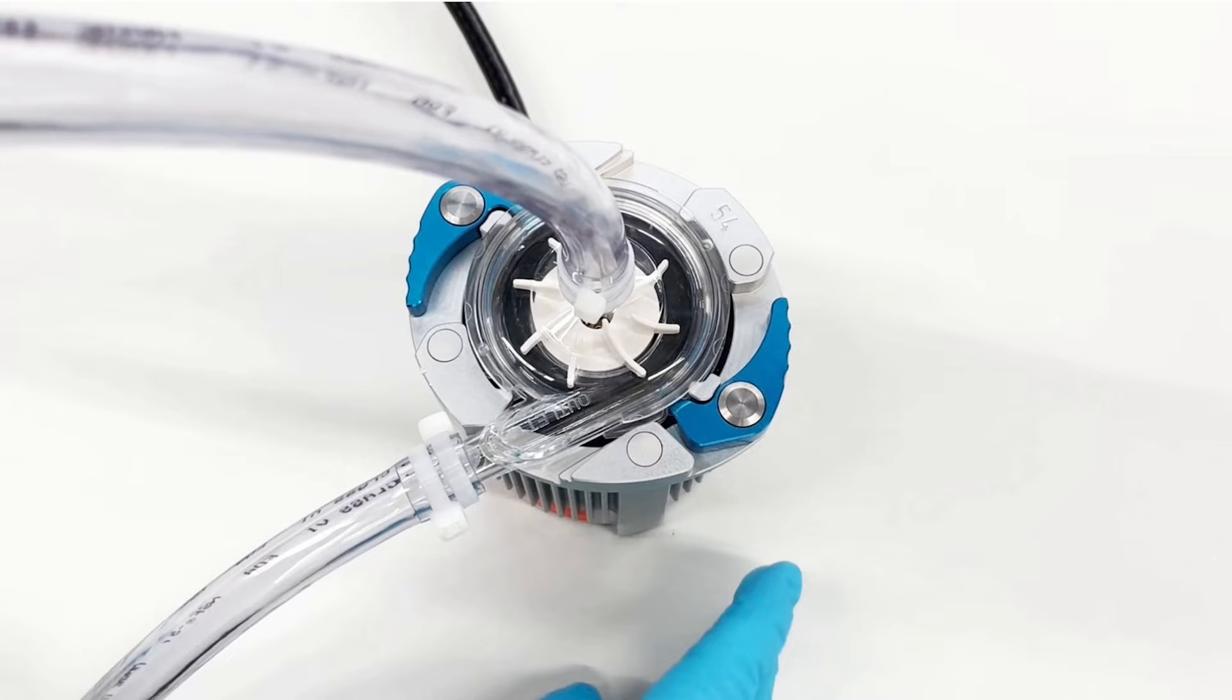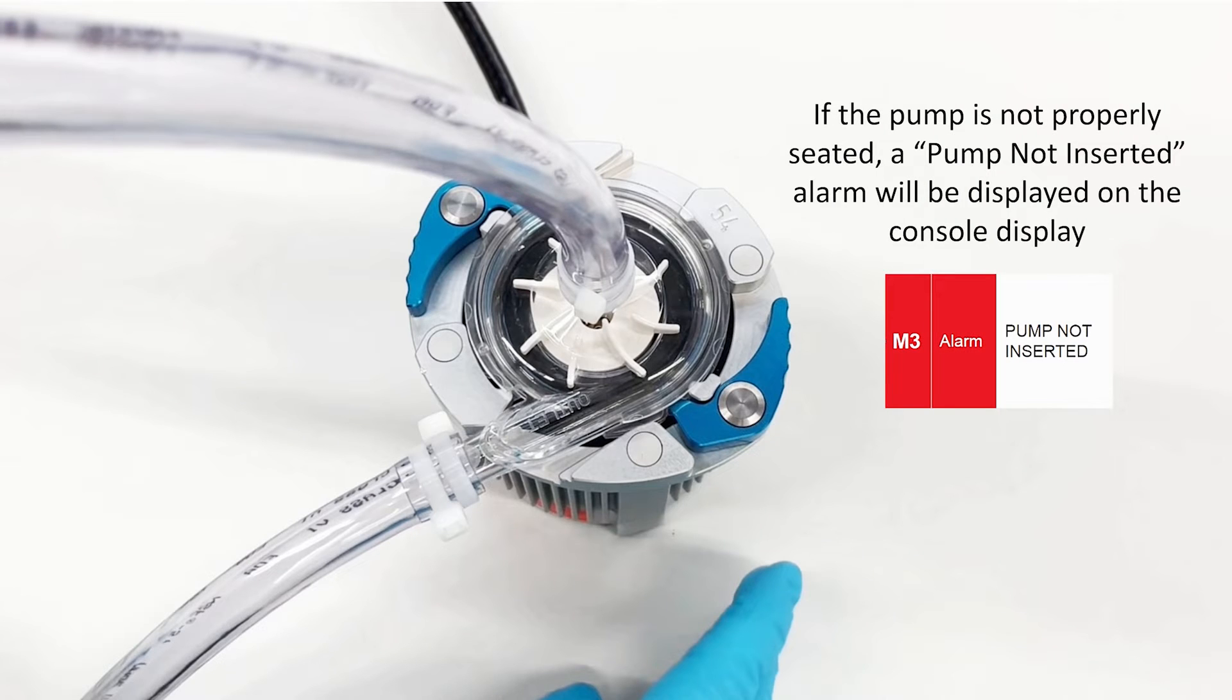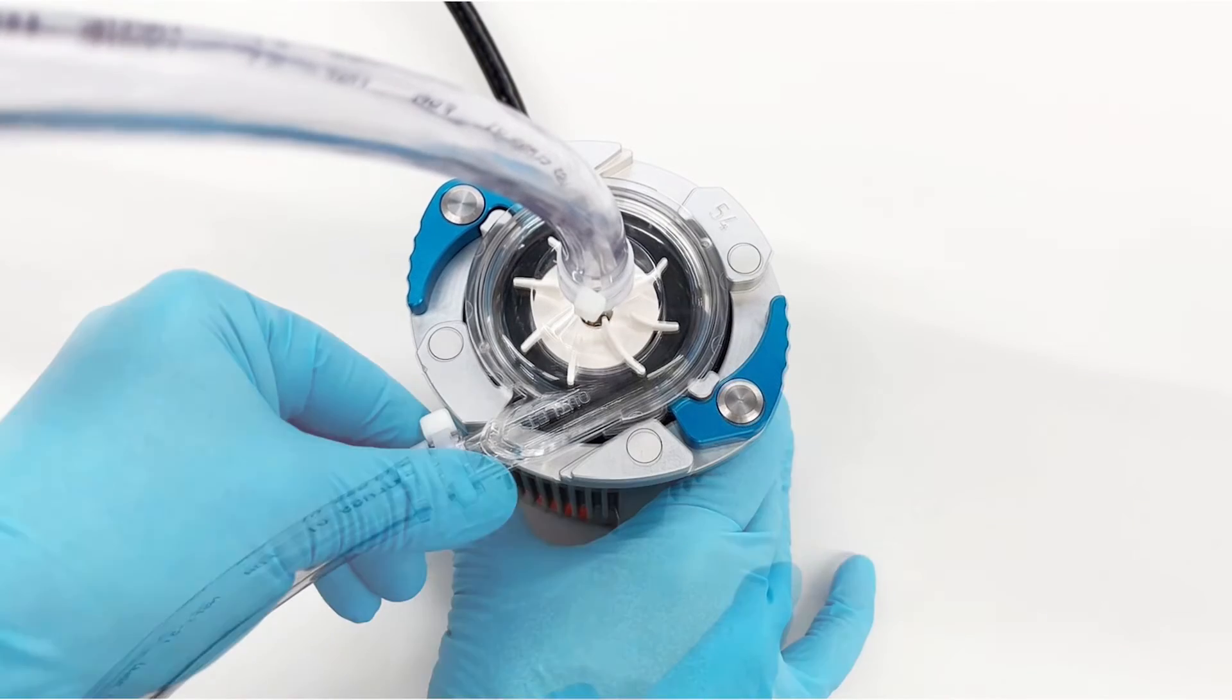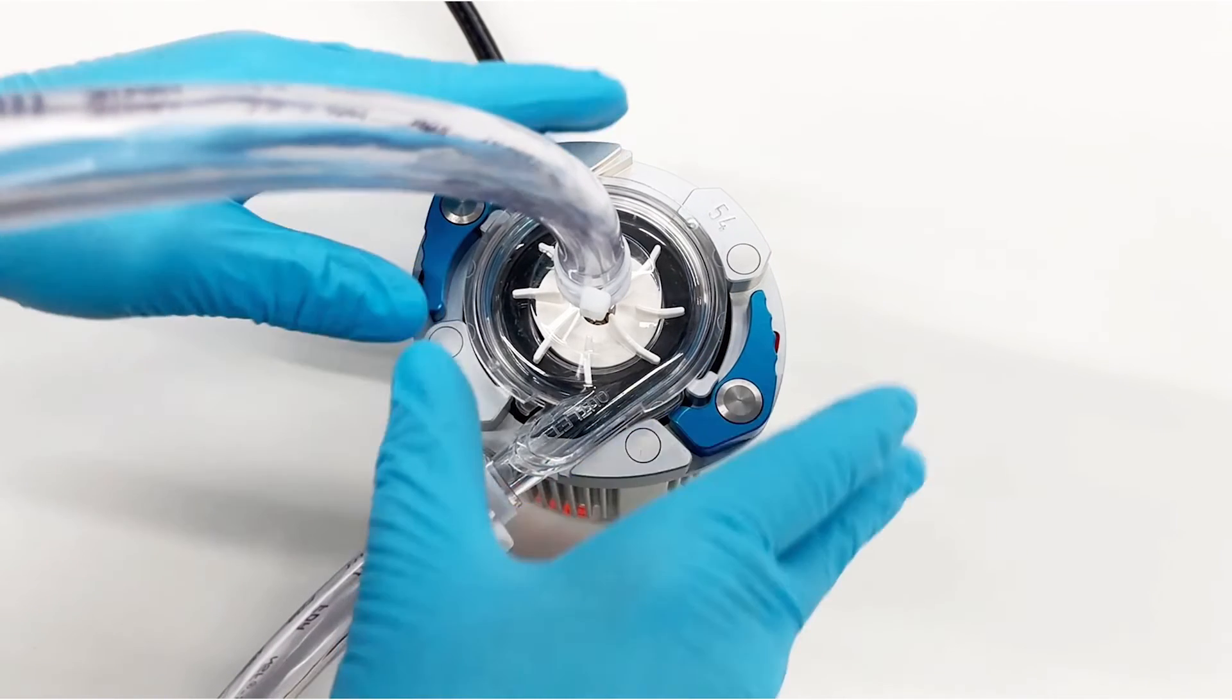Once locked, the levers will be completely extended and the red indicator will no longer be visible. If the pump is not properly seated, an alarm will be displayed on the console display. To remove the blood pump from the motor, squeeze both locking levers and rotate the pump counterclockwise.